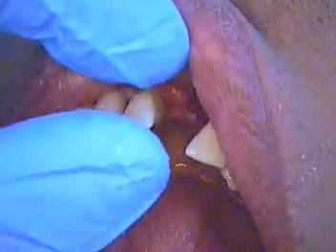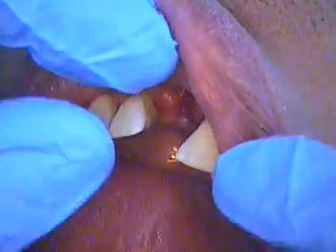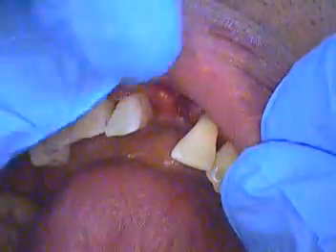So what we have to do at this point is get your bite perfect when we put this in. I'm just tacking it in. So when I ask you to close, I want you to close on your back teeth — not your front teeth, but your back teeth. I'll try to tack it in to where I like it. Also just relax your tongue; we don't want your tongue involved. Have the light ready for me, please.